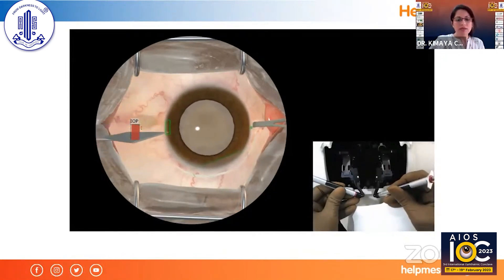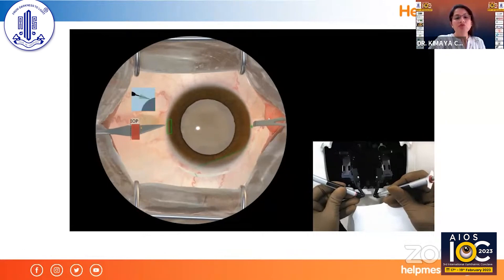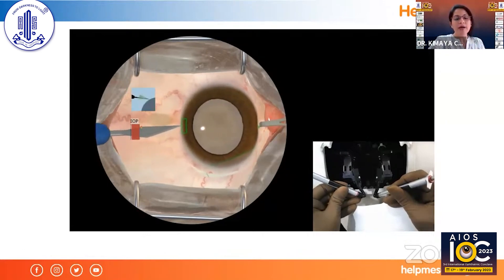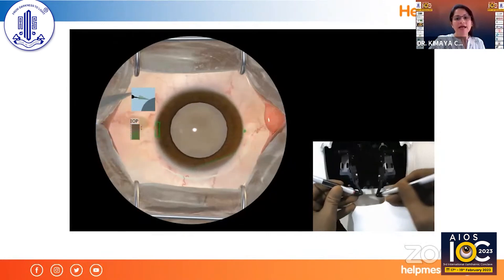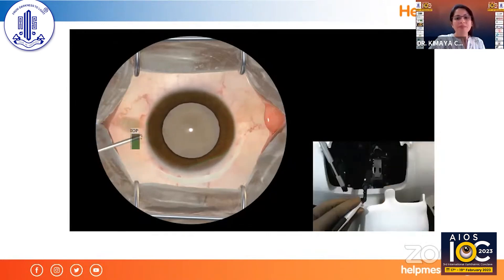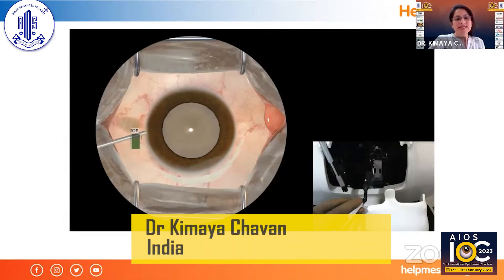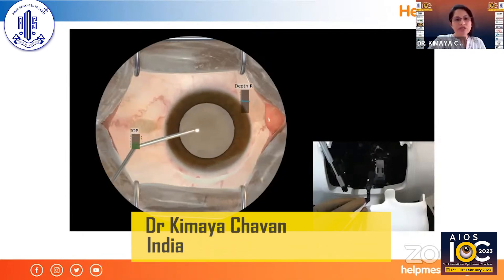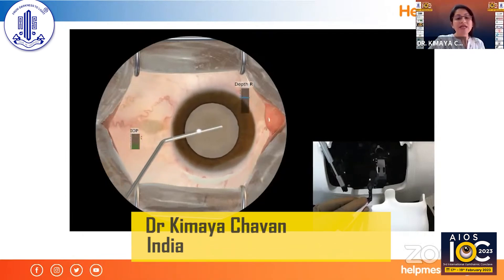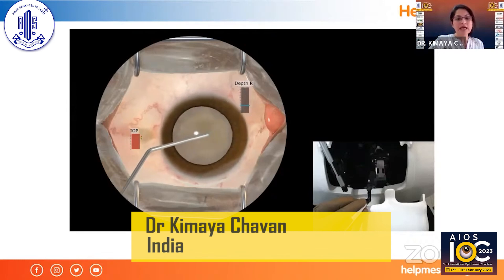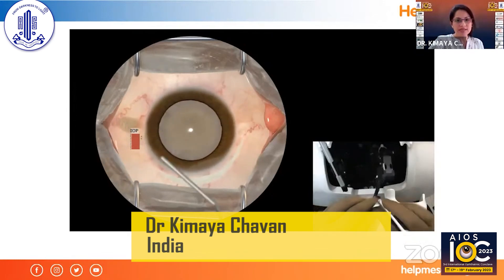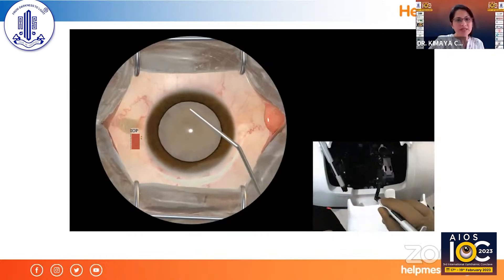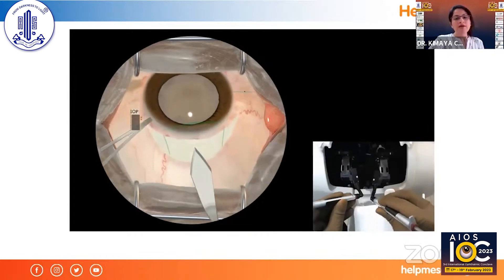Now I've chosen the paracentesis program. I'm doing it with a 15-degree stab blade in the left hand, colibri in the right hand, and I'm injecting viscoelastic inside the eye. Once I start injecting, I can really feel the depth of the anterior chamber and also the intraocular pressure rising as the viscoelastic goes in — it is actually unbelievable but that is the case.